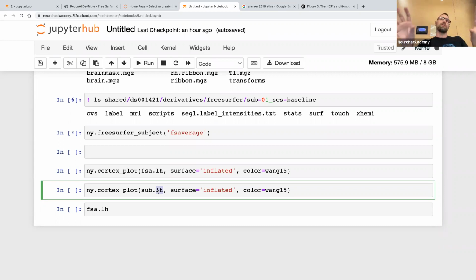And then you've got two choices. One is you can just take the nearest vertex to it and say that's the value I'm going to assign to the subject's new values. So that's nearest interpolation. That's just saying these two sets of points are in register. For every point whose value I want, I'm going to take the closest point in the atlas hemisphere. The alternate way is to do linear interpolation.